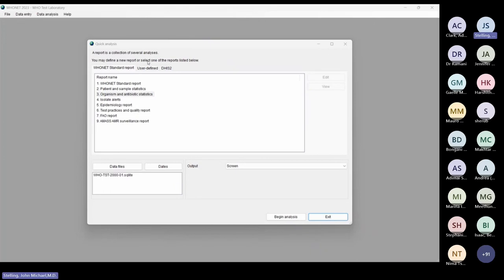So what have I just done? I clicked on organism and antibiotics, report number three, chose a data file, and began the analysis. I talked a lot about the analyses to take advantage of our time together, but you can see how easy it was to get a lot of information with very little work.